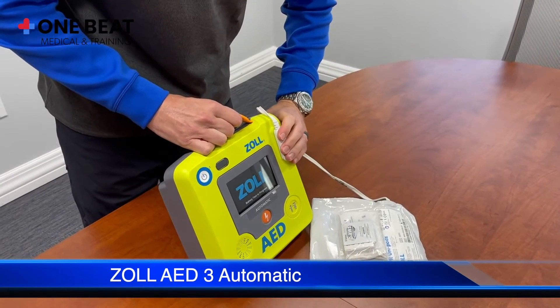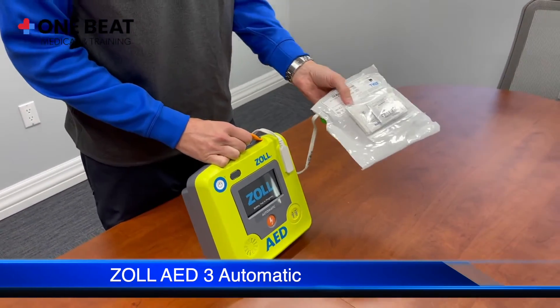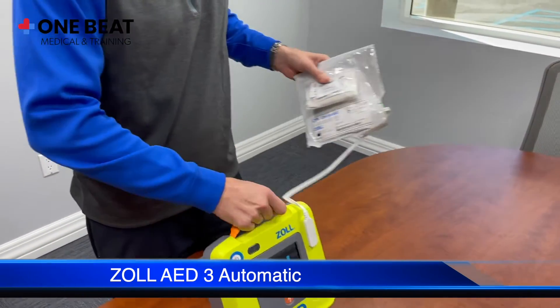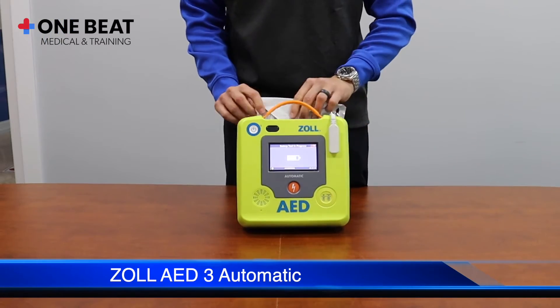Take the cable connector from the pad package and plug it in firmly. The electrodes have a rescue kit attached. Place the pads in the pads holder on the back of the AED with the shears facing in.